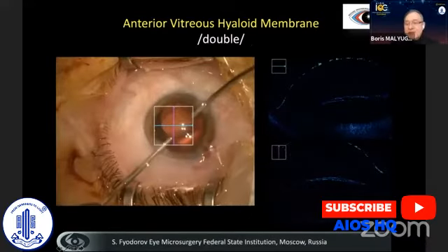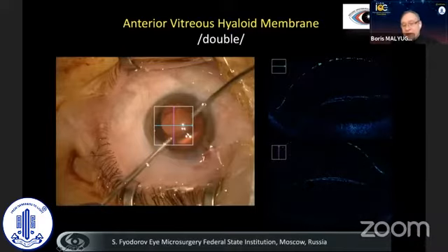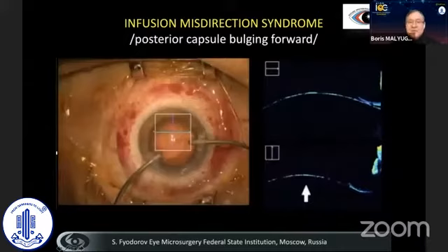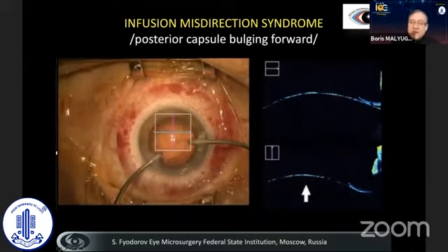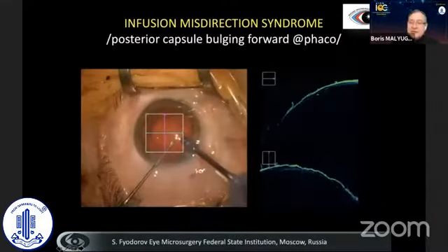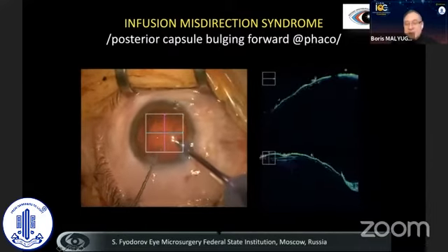Occasionally we see this image of the split anterior hyaloid. This is the posterior capsule bulging forward during irrigation aspiration, and this is the anterior hyaloid, which is split into two pieces. Here is how the bulging happens: irrigation fluid goes through the zonules and pushes the capsule in the direction of the anterior chamber.